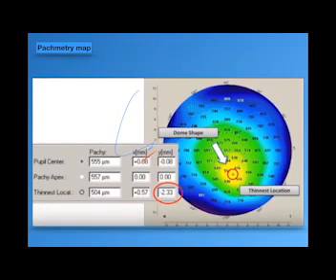Normally, the thinnest location should be at the apex of the cornea. If it's shifted away from the apex, you have to consider the difference, and you have to consider the distance between these 2 points. We have vertical deviation and horizontal deviation. Which of them is more important?